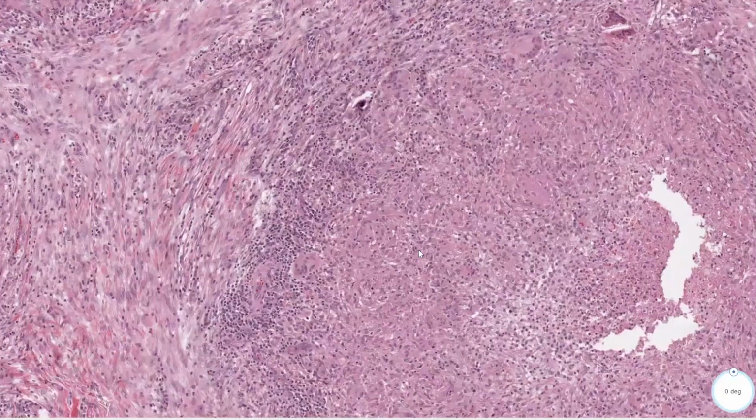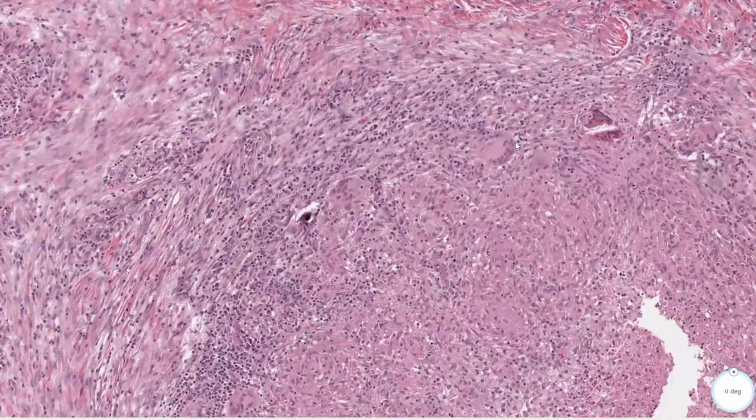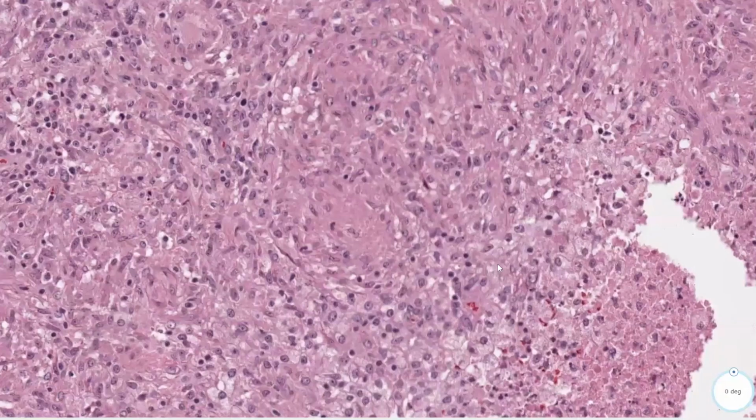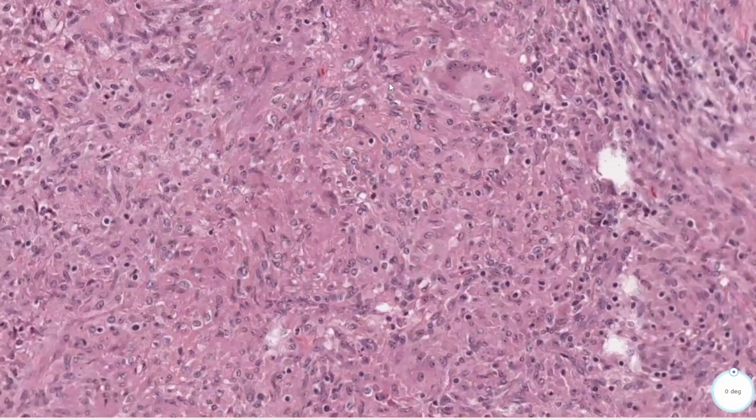And an important point here is that it's important to stain at least one block or multiple blocks ideally, because these can be really focal. And you really have to hunt for these organisms at least 40x, spend some time to look through them, because in this large section, you may only find a few organisms, and that is clinically relevant.